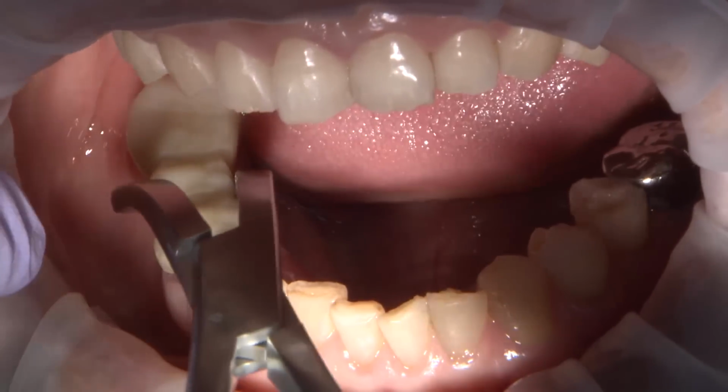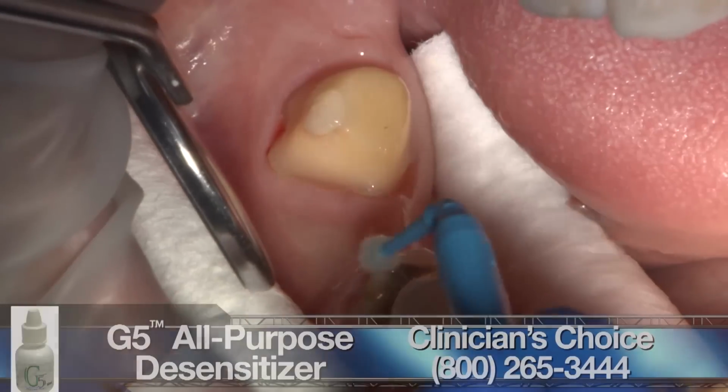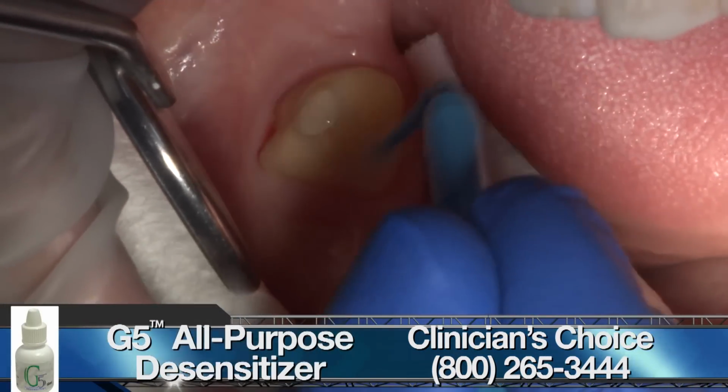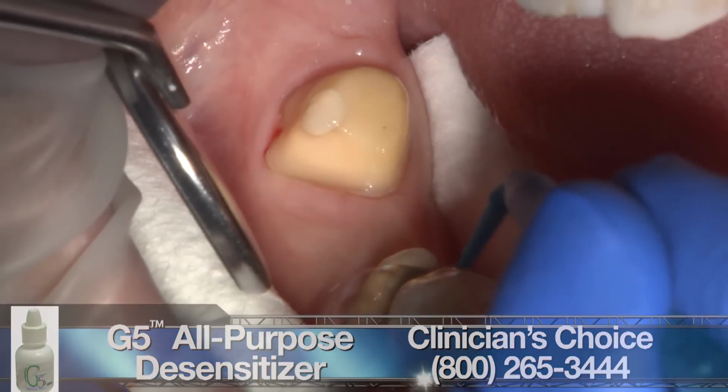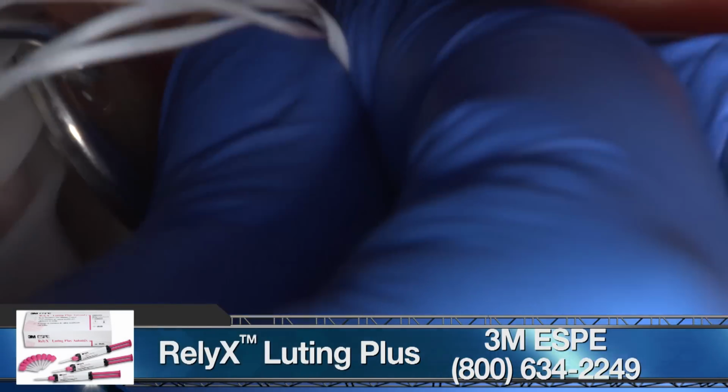And here is the final appointment after the provisional bridge was removed. Preps were cleaned and desensitized with two consecutive coats of G5 before the final cementation. A 3-unit Obsidian pressed-to-metal fixed partial denture was cemented in place using RelyX Luting Plus.